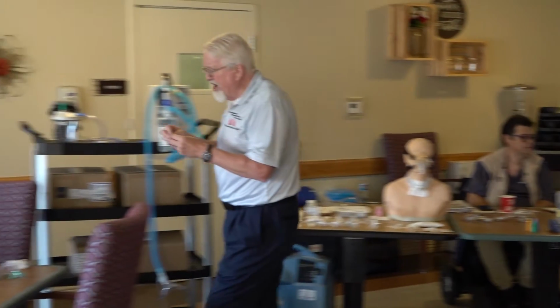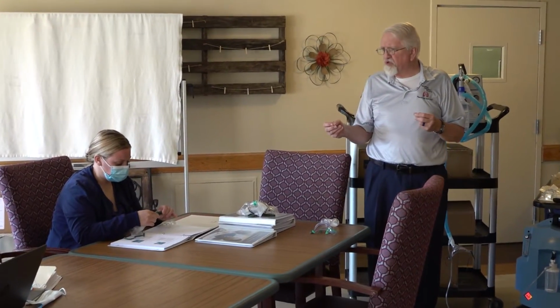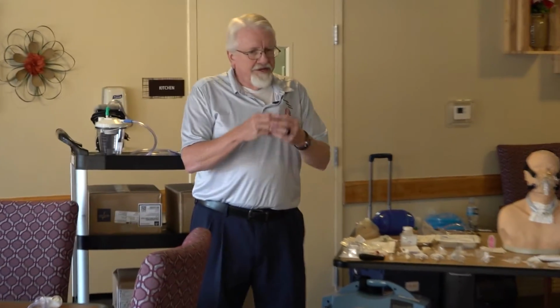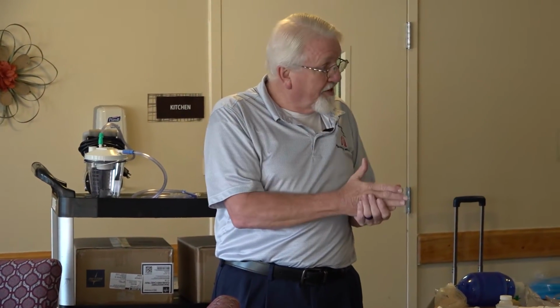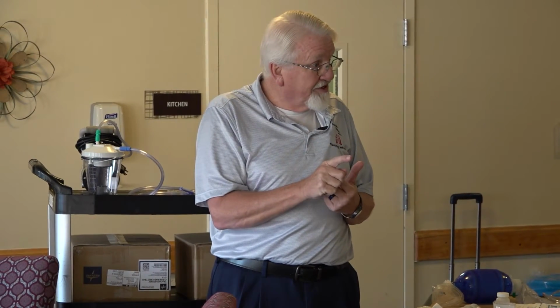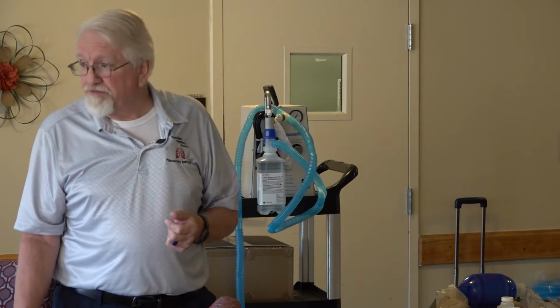Okay? And so when you pull that, you're going to line up your crow's feet accordingly to the FiO2 you're wanting to achieve. So when you document this, if you have it set at 28%, you make sure you document 28% at 3 liters Venturi. Okay? Make sure you note Venturi. Does all that make sense?